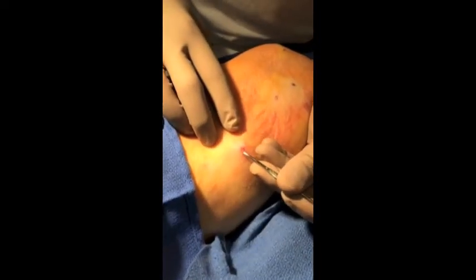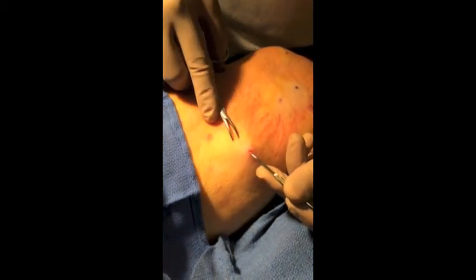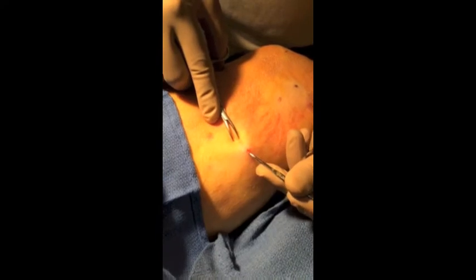Now, what we're going to do is a little tumescent and do a phlebectomy. We're doing the phlebectomy right here — you can see the vein coming out. We've already done these two; we're going to do every place we mark. We do a little phlebectomy, take out the feeding veins. And then after we're through, we'll show you what it looks like when we've completed the procedure. That's the phlebectomy — we're going to do it in about eight locations.